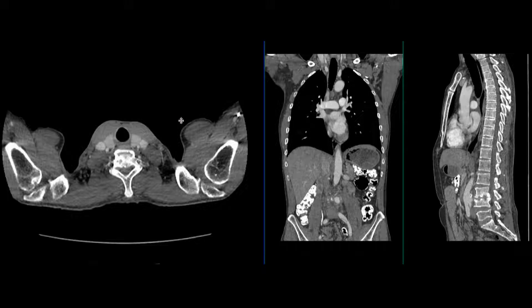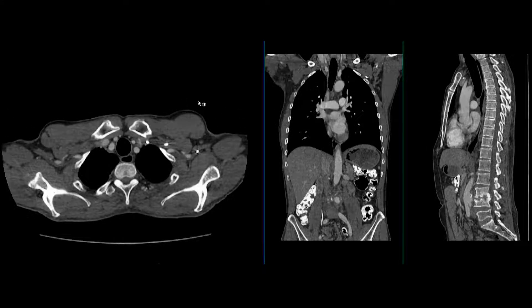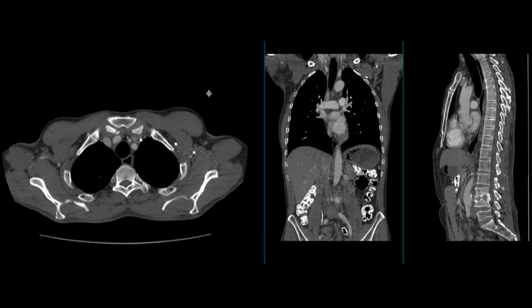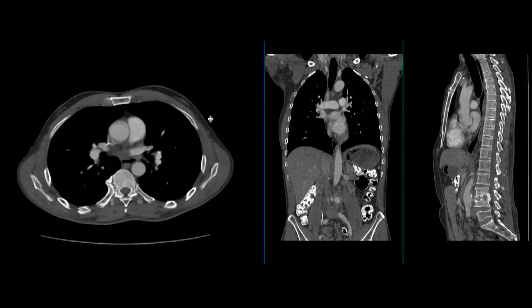This case involves a 58-year-old gentleman who presented to the emergency room with back pain, with concern for an aortic dissection or aneurysm. A CTA of the chest to pelvis was performed. I'll review some of these images on the axial portion here.